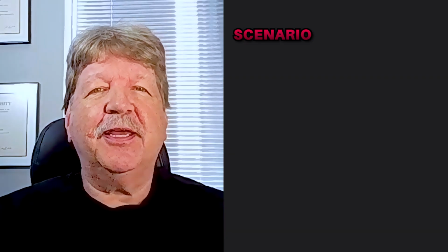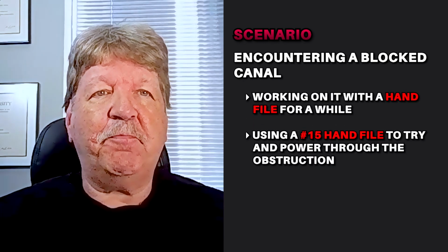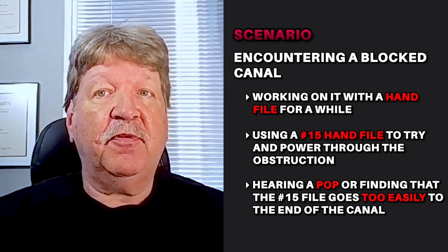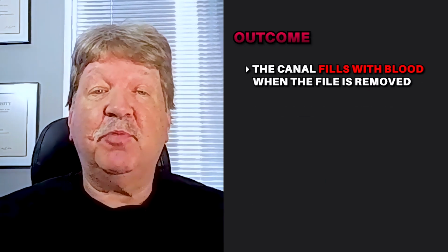Here's the scenario. A canal seems blocked, and we work on it for a while. We then reach for a number 15 hand file and attempt to power through the obstruction, only to hear a pop, or find that number 15 file now goes a little too easily to the radiographic terminus. You remove it, and the canal fills with blood.